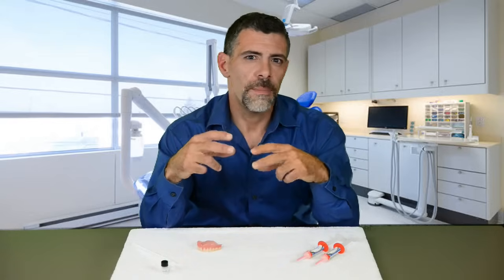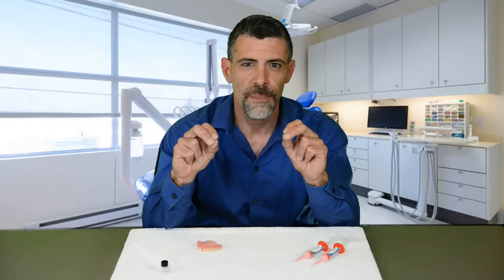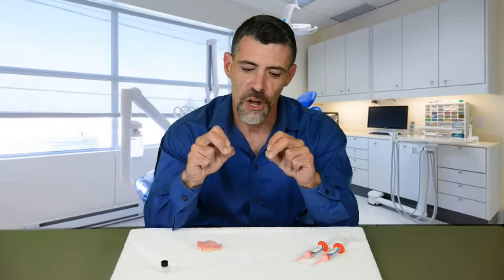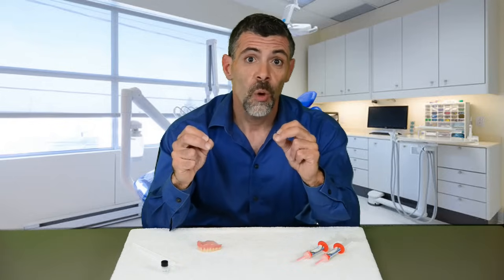Denture Fit fills the voids in your trough and makes a new detailed impression of your roof and gum, filling all the nooks and crannies in the trough of your denture. When all those voids are filled in your gum line, your denture can then stay supported in your suction spot.